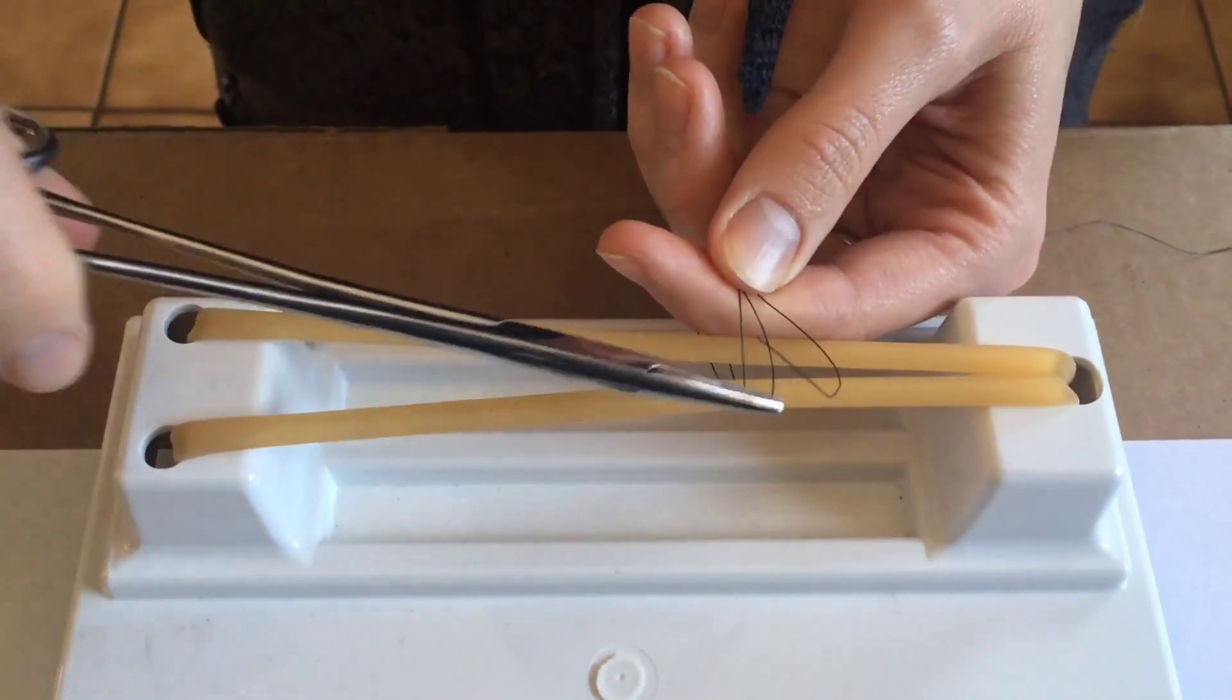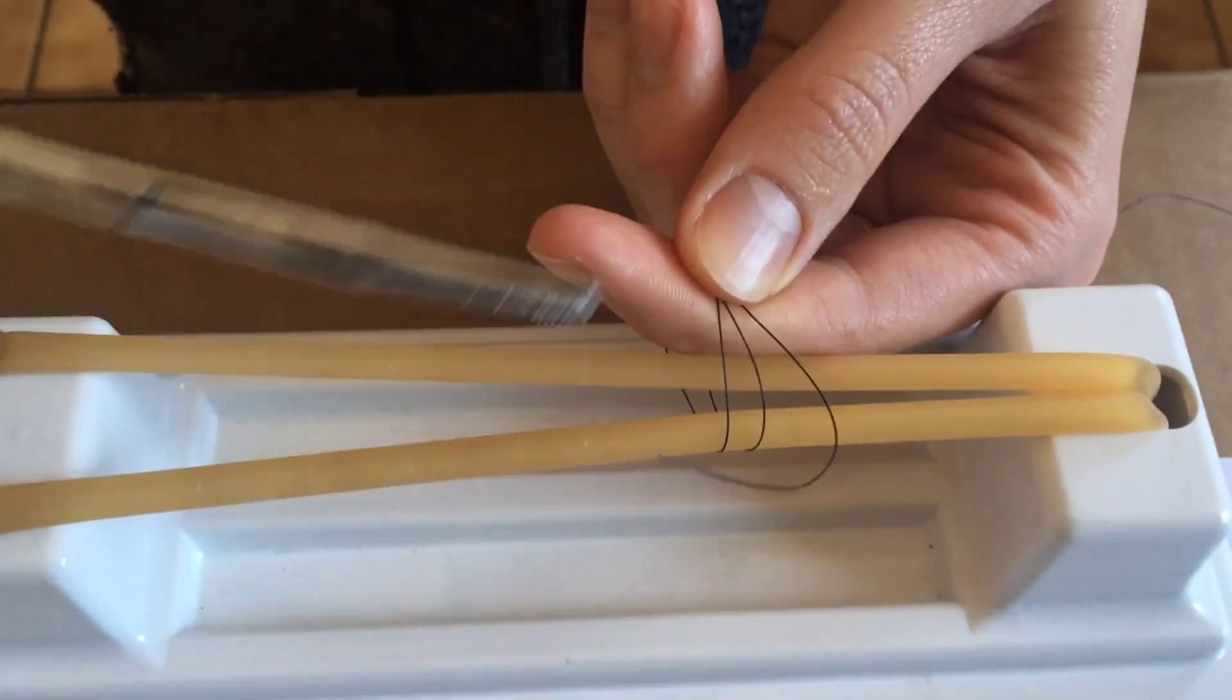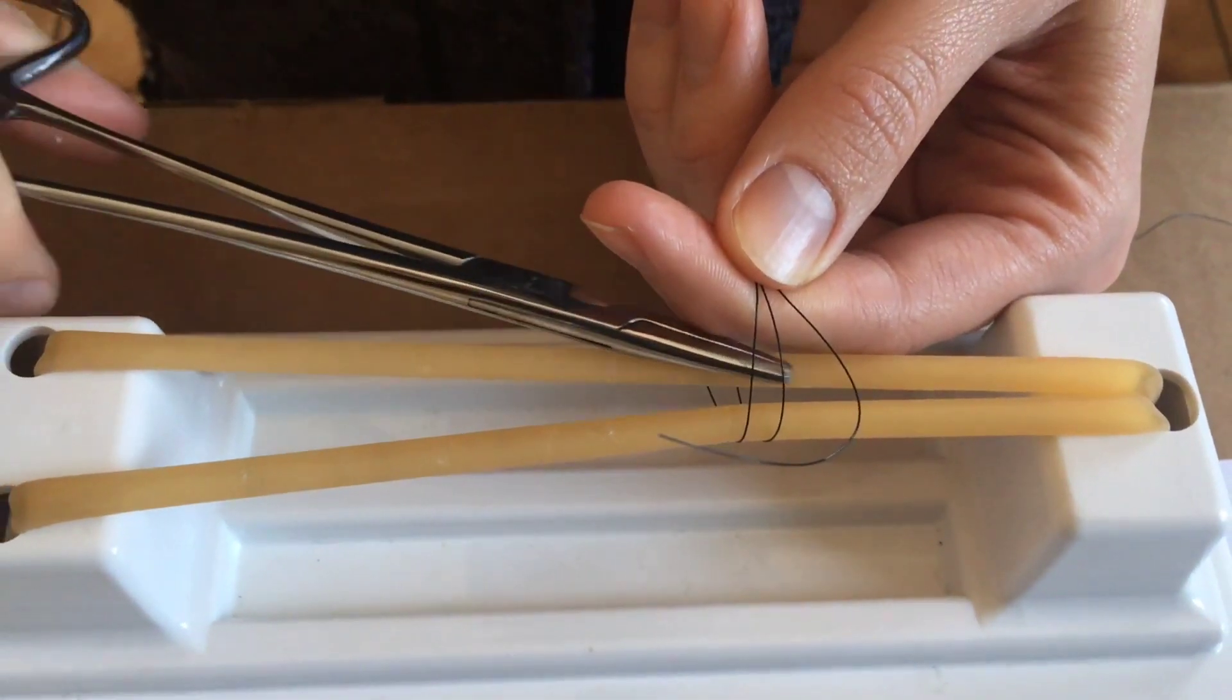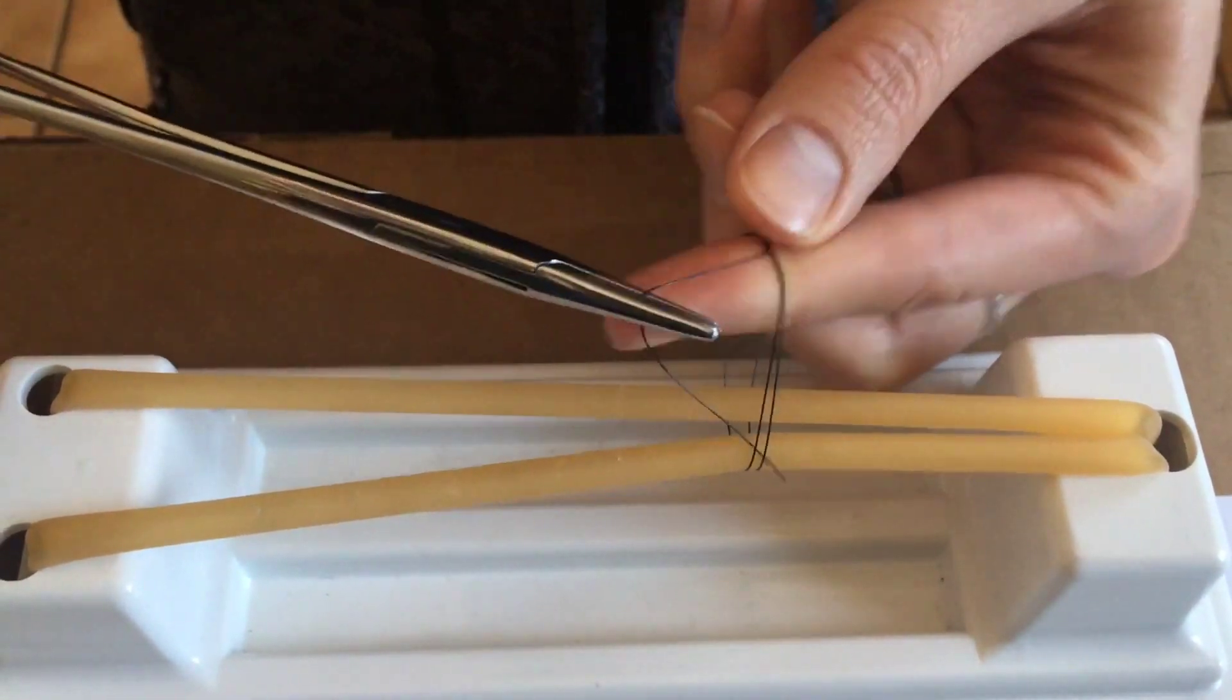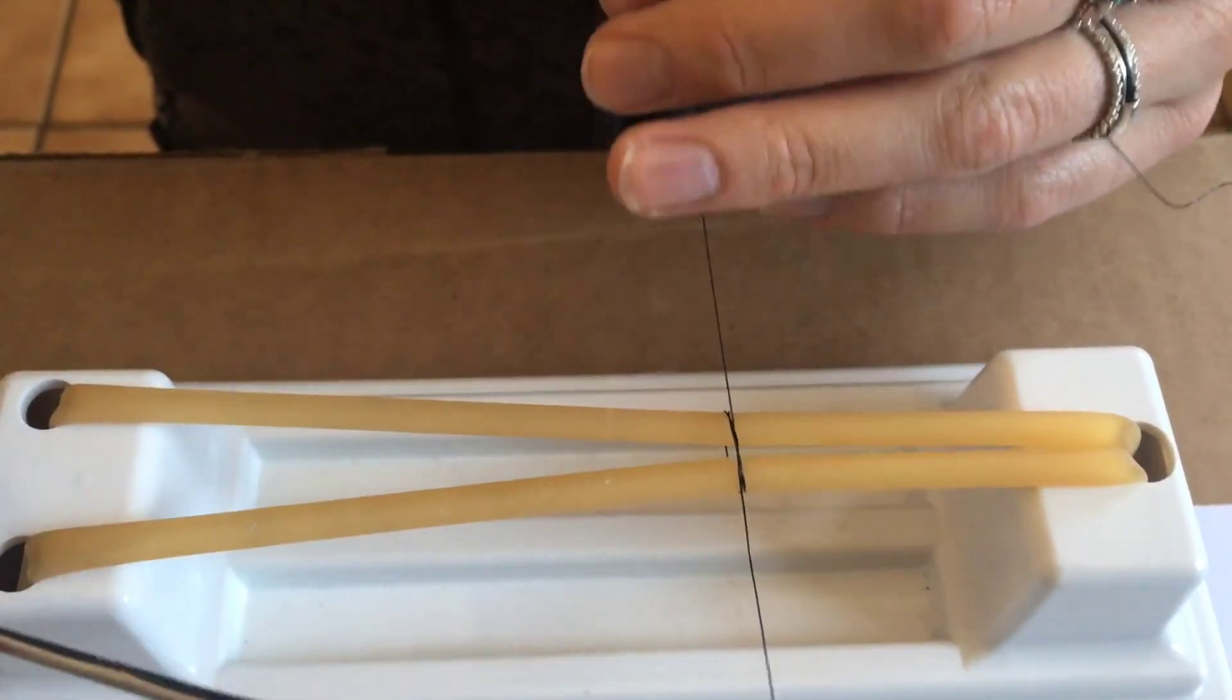Now you have two loops. Stick your needle drivers through these two loops, grab the end of your suture, pull it through, and cinch down.